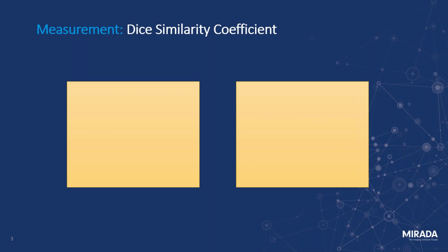And rather than trying to explain it using the figure from the paper, I'd explain what the method is using simple geometric shapes. So we take these two shapes and imagine that they've been auto-contoured by some auto-contouring system. We have the contour on the left, which is roughly the right shape, and the one on the right, which, again, is pretty much the right shape, but maybe misses part of the contour on the right-hand side.